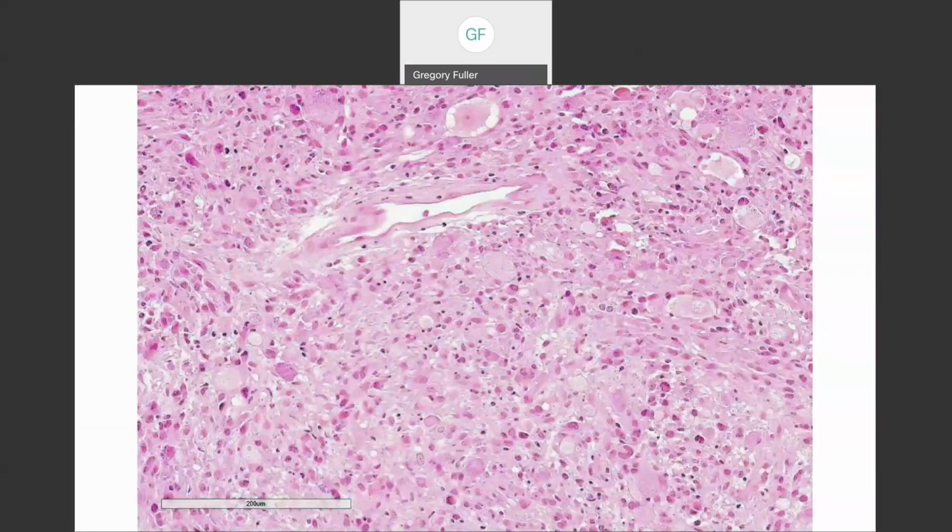Here's the histology. What's your diagnosis? I'm just going to show you the one H&E panel. You should not be thinking pilocytic. It's not spindle, okay? Bottom line is you should be thinking it's either PXA or ganglioglioma because you see big cells. There's one up top here. These big cells, that one has a prominent nucleolus, and I don't really see Nissl substance, the rough endoplasmic reticulum.